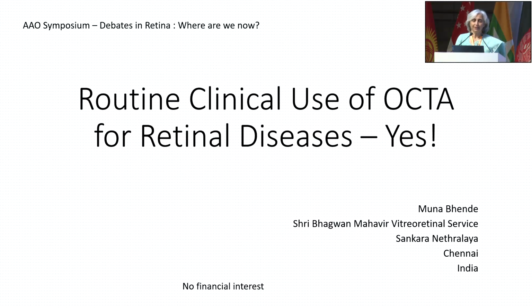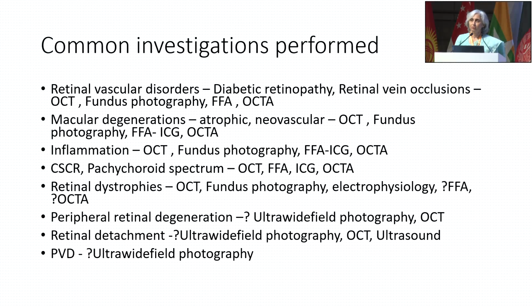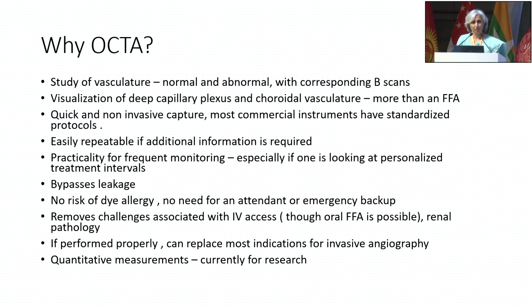So I will be speaking in the next few minutes that there is definitely a role for routine clinical use of OCTA in the retina clinic. These are the common retinal disorders we see in the retina clinic, and if you look at the investigations we do, OCTA forms part of the investigation for almost half of them, maybe a little more.